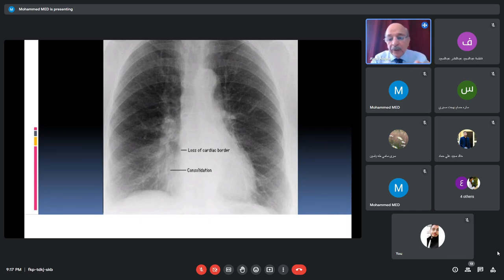If the lesion is well demarcated, and I will show you some well demarcated lesions, then this is either secondary, meaning malignancy coming from elsewhere, metastasizing to the lung, because if they metastasize to the lung, usually they don't invade. Okay, this is number one. Number two is that it could be a benign tumor, like benign adenoma of the lung, because a benign adenoma does not infiltrate.